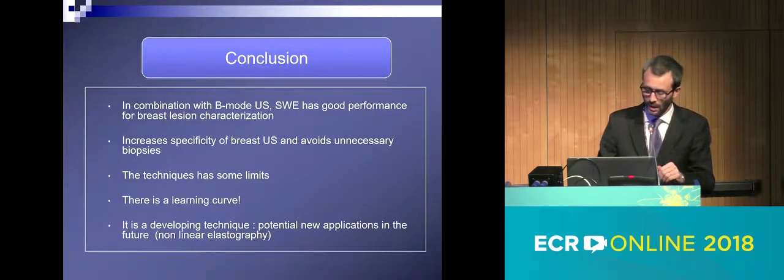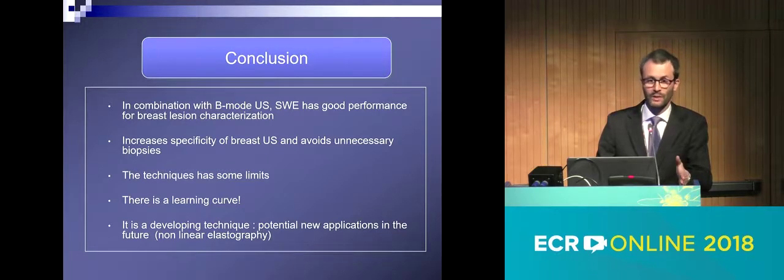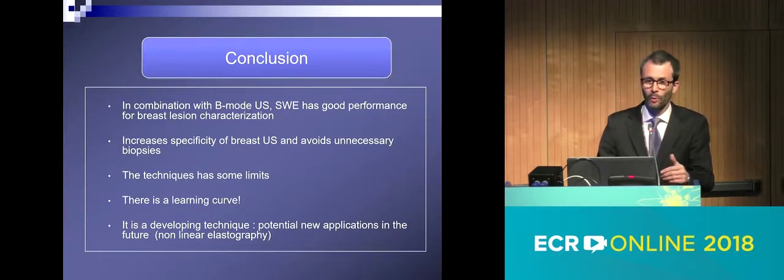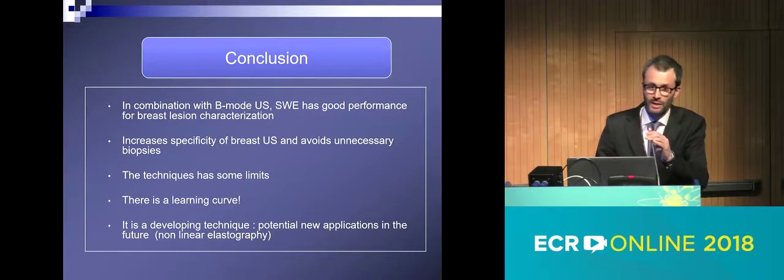So as a conclusion, I would say that in combination with B-mode ultrasound, shear wave has good performance for breast lesion characterization. It has been widely shown in literature. It really increases radiologist performance, increasing in particular specificity, and then avoiding unnecessary biopsies. But you have to be aware that the technique has some limits. There is a learning curve, so you have to learn it. And in my opinion, if the technique is still not used by all the radiologists in the world, this is because it's not taught properly all the time.